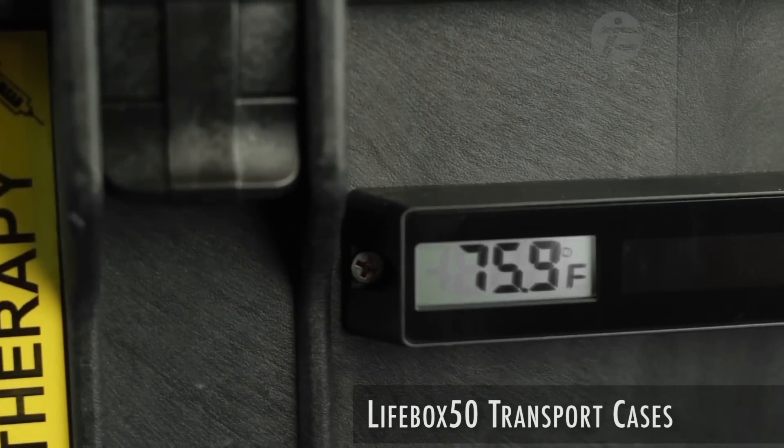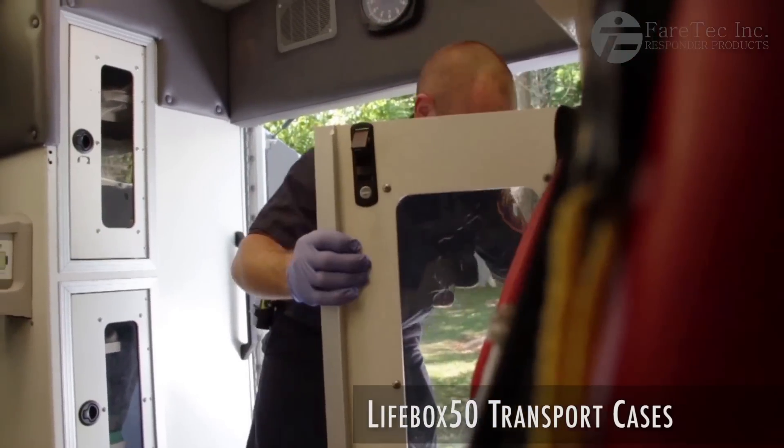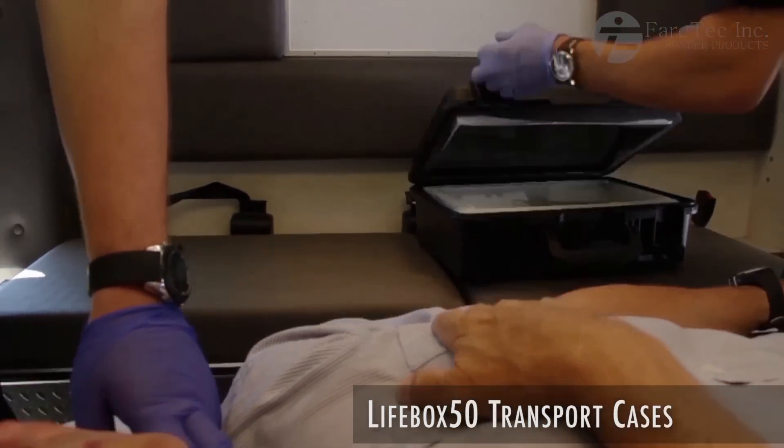A surface-mounted digital thermometer allows the user to verify the payload temperature at all times, and the insulation components of the case hold the payload at their appropriate temperature for 30 to 50 hours.